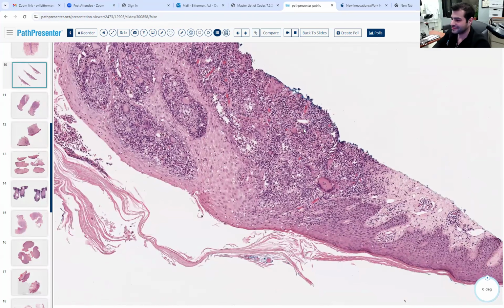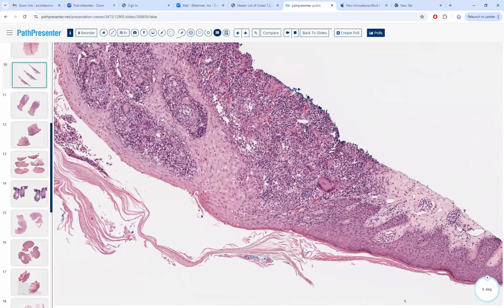Pseudoepitheliomatous hyperplasia with that neutrophil component. What's that? Pseudoepitheliomatous hyperplasia with pus. Here comes big green leafy veggies. The 'here come big green leafy veggies' differential. What's that? Histoplasmosis, chromo... wait, H is what? Halogenoderma. Halogenoderma, yes, but histo can do this too. Yes, you're right.